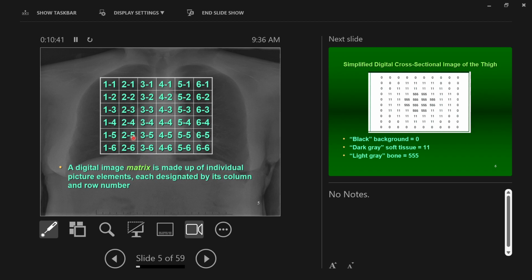Are there digital radiographs that use vector imaging instead of pixel imaging? Ooh, vector imaging. I know what a vector is. What's vector imaging? It would be like, it decides where the mathematical terms of the image are, and then you can blow it up as big or small as you want.